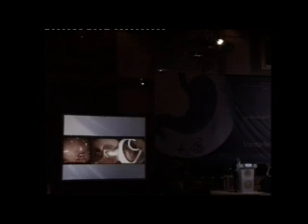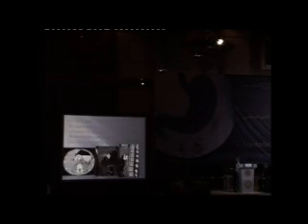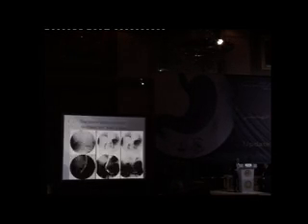As you can see here, this is a guide wire, a 10 millimeter balloon dilator, followed by 2 double pigtail 10 French stents placed. After that, the patient did very well, discharged a few days later, and when he came after 9 weeks, no more fluids, no more pseudocysts, and these are the stents. After we removed them and did a pancreatogram, you see the pancreatic duct is completely normal. So it seems that once you relieve the pressure by allowing the leakage to be drained, then the pancreatic rupture site will seal off, and we removed these pancreatic cystic stents, and the child did very well without any symptoms.